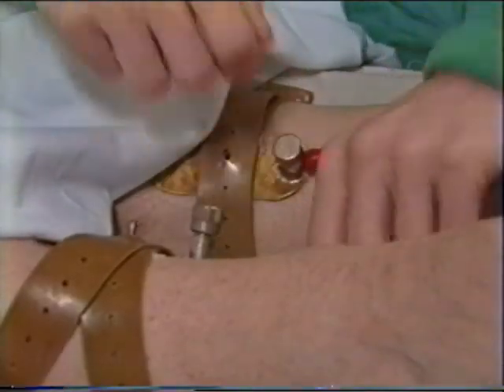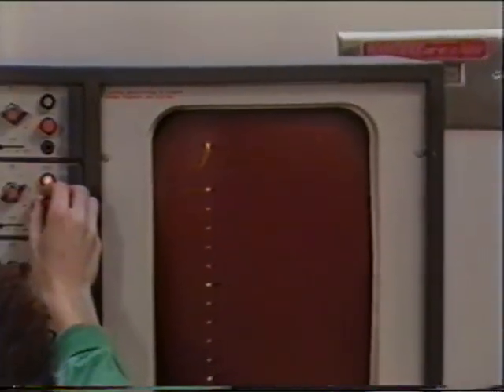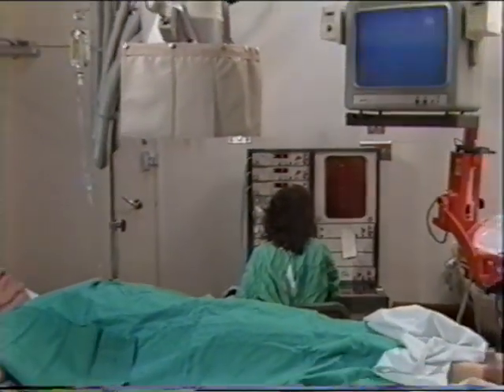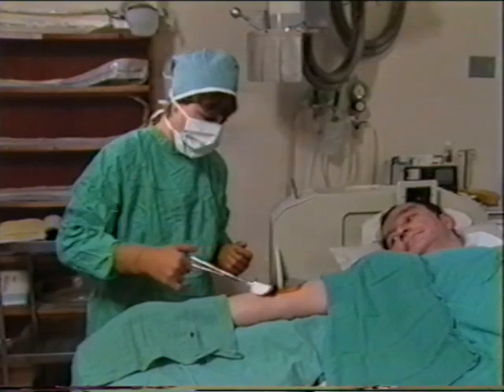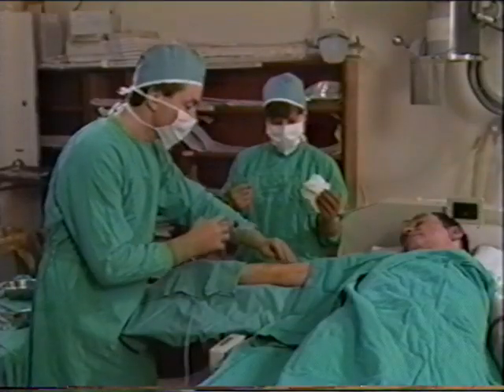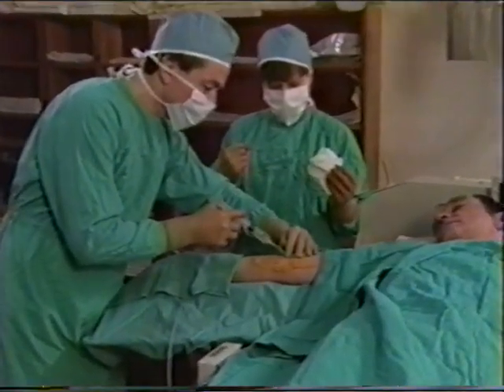Electrocardiogram leads will be placed on your arms, legs, and chest. The other end of these leads will be connected to a machine that will record your heartbeat on a graph. The shaved area in the middle of your arm or groin, where the catheter will be inserted, will be washed with an antiseptic solution to prevent infection. This same location will then be numbed by injecting a local anesthetic.